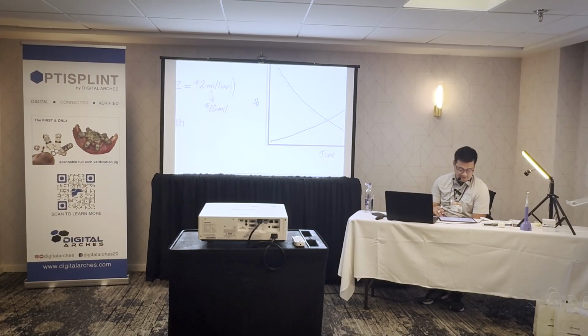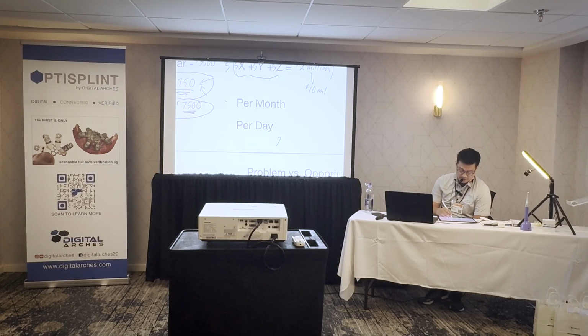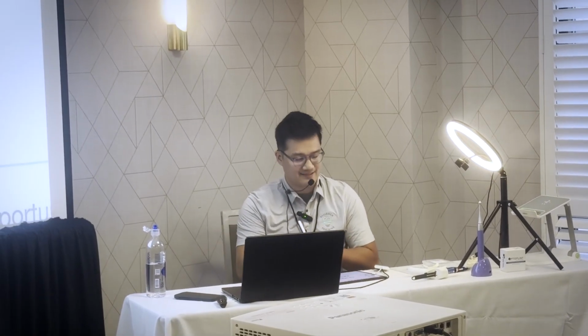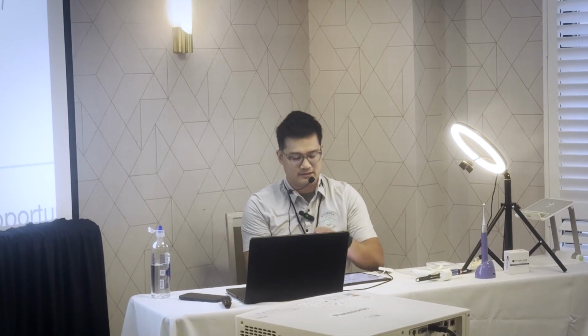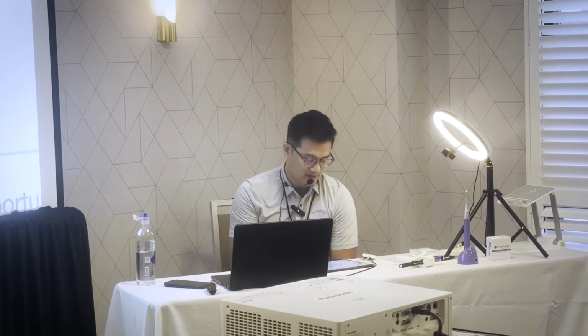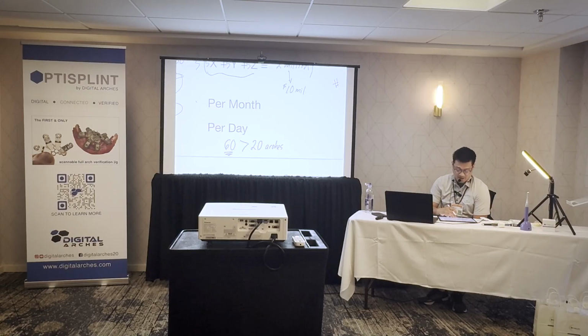And so what we found is in our lab, we charge out about 20 arches a month. Those are finals. And it takes about 60 cases in the lab to build out 20. Those 60 are in some phase, whether we're designing a temporary or a prototype, or they have a prototype and we wait for it to come back. Usually every month, 1/3 of those goes to finish to build out. So a very easy metric is that per month, I have to basically build out 20 arches.